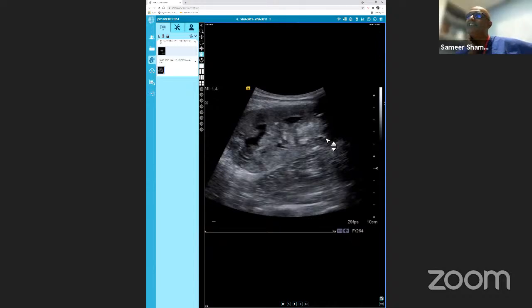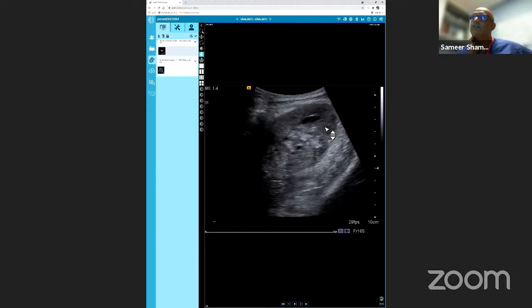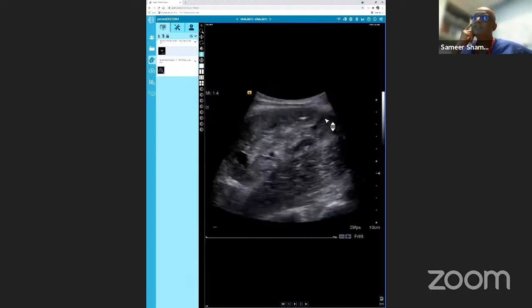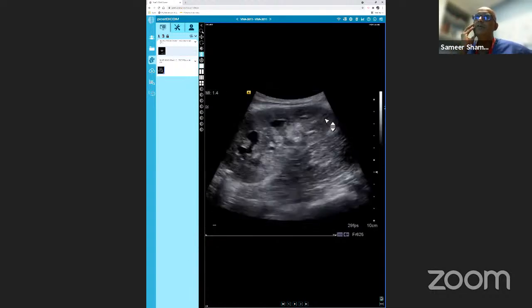In the exam, you can put it in a very nice way, saying that it's very difficult to interpret ultrasound images performed by someone else. You just have to talk through the image, saying it's a very difficult case to discuss because you haven't scanned it and you don't have the correct clinical picture. Basically, the patient has had a transplant and it's not working, and it's within the first 48 hours. So what are the complications you would look for in the first 48 hours post-transplant?